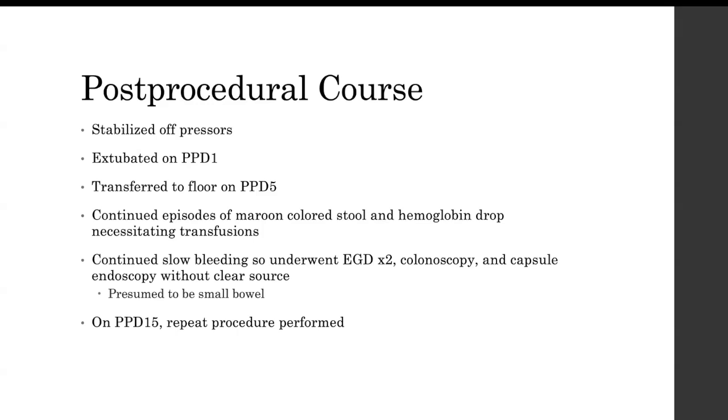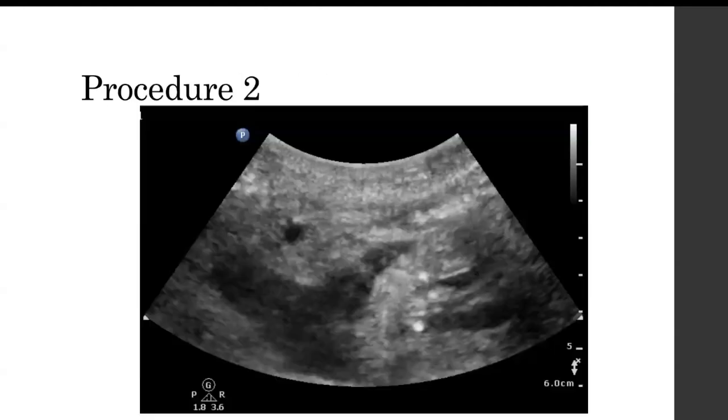And that's called a mesocaval shunt. A mesocaval shunt goes from the mesenteric veins into the IVC directly. Does not go through the liver. Does not go through a normal channel. So what I did, this is very hard to interpret, but there was, go back.